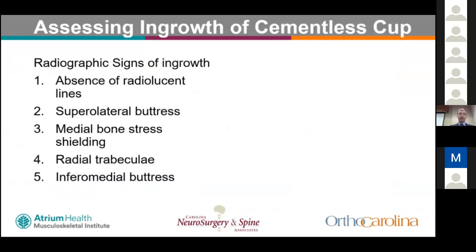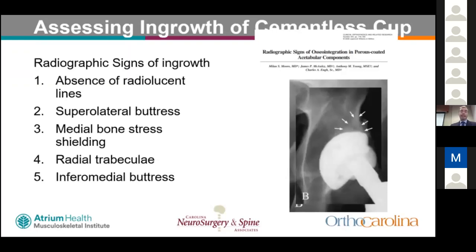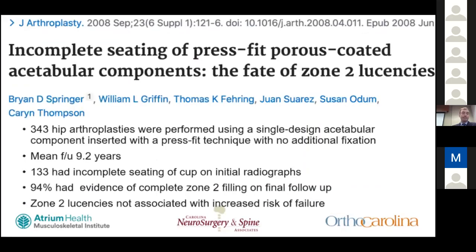Regarding radiographic signs of cementless cup ingrowth: absence of radiolucent lines, absence of migration on sequential x-rays, a superolateral buttress, medial bone stress shielding, radial trabeculae, and an inferomedial buttress are all signs of a well-ingrown cup. A Charlotte study of 343 hip arthroplasties found that 133 patients had incomplete cup seating on initial radiographs; 94% of those had complete zone 2 filling on final follow-up at a mean of 9.2 years, so zone 2 lucencies do not significantly affect long-term outcomes.